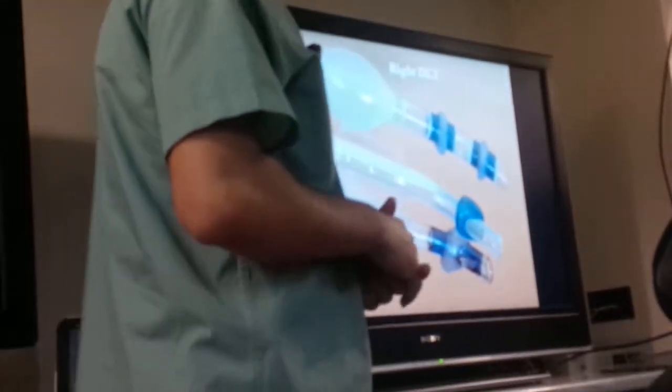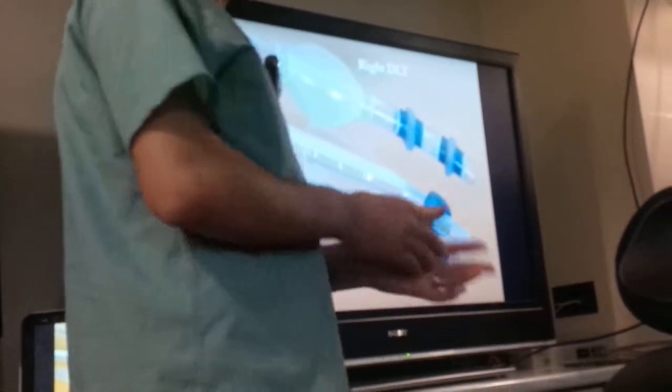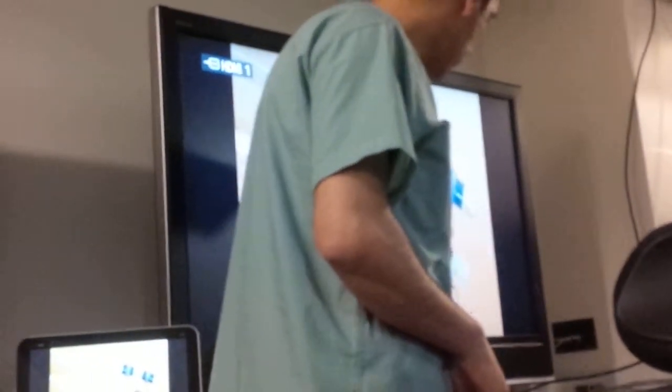This is the right double lumen tube. I didn't use it any time in this hospital. We never have a procedure in the left main bronchus yet. But this is the only indication for this double lumen tube. You can see here there is a slot. It faces the right upper lobe. So when we put it, this slot should face the right upper lobe bronchus.